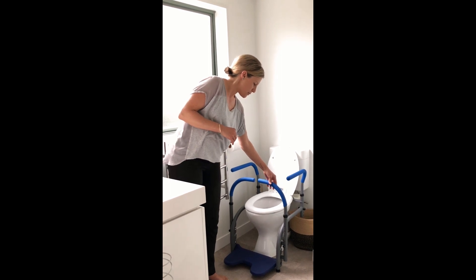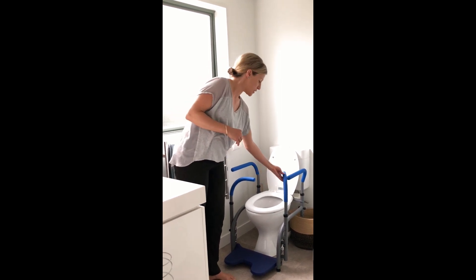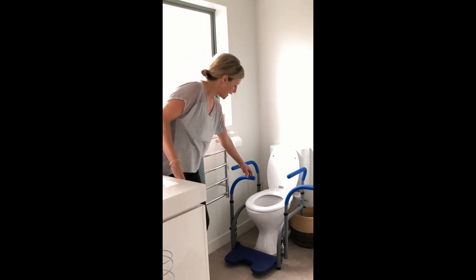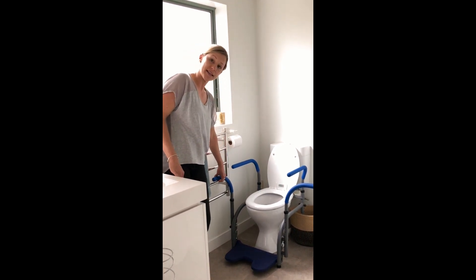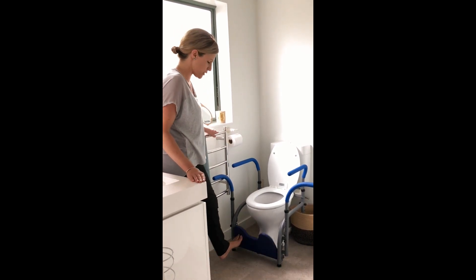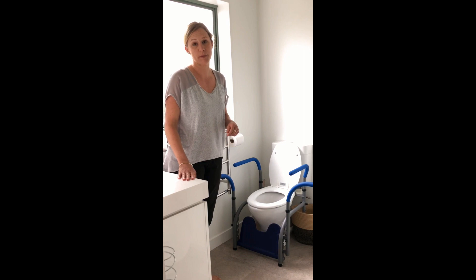Each of these swings away and it's got 4 different positions that they can lock into. Additionally, it has a foot plate accessory and this can be at different heights and also flipped away when other people are using it.